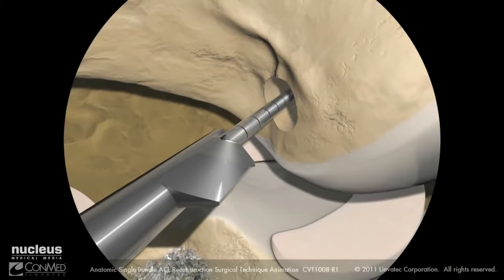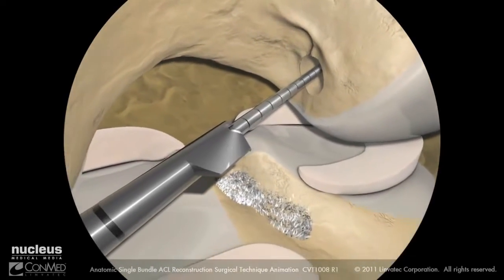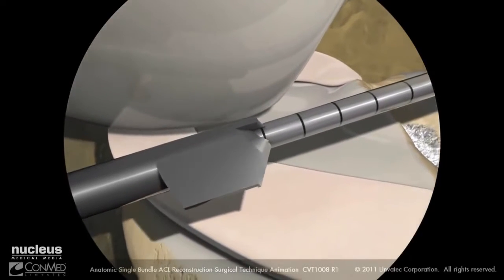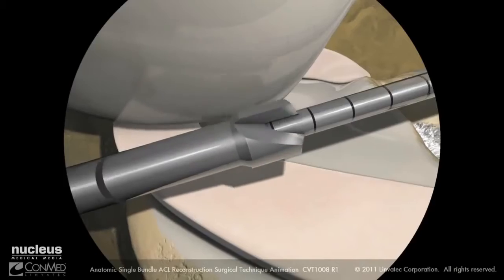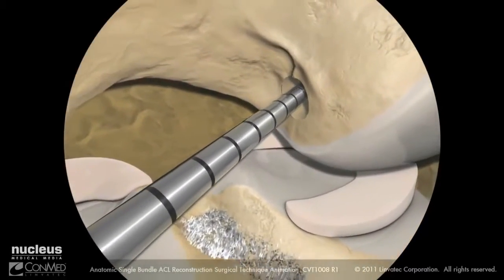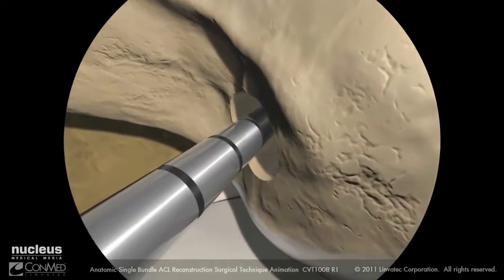Keeping the hand off the trigger, slide the sentinel drill bit past the medial femoral condyle and out of the portal, making sure to keep the blade oriented away from the condylar surface. Using the XO button drill bit to drill the femoral channel, advance the drill bit through the lateral cortex.